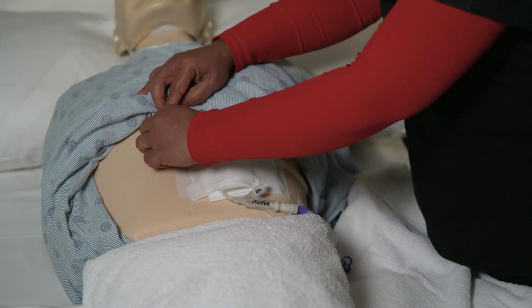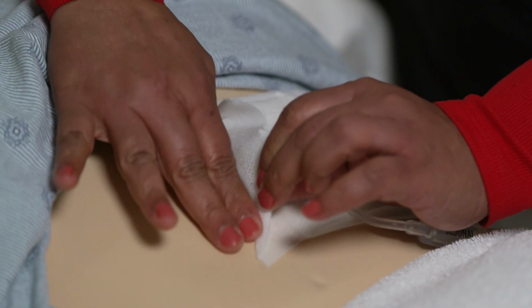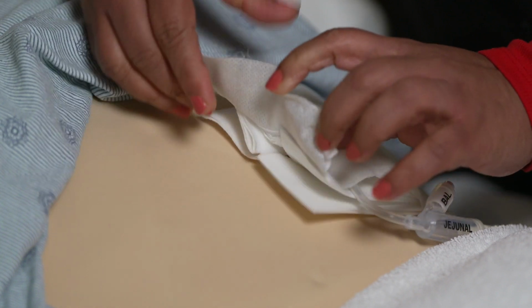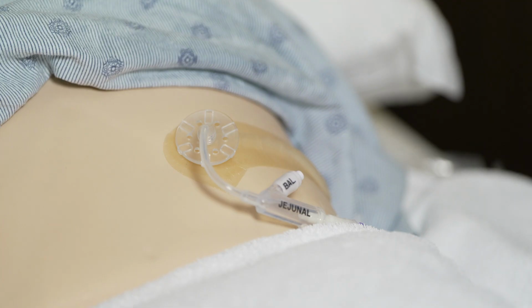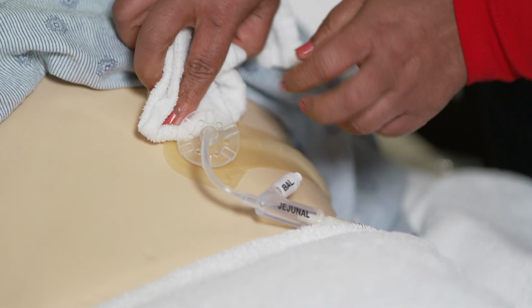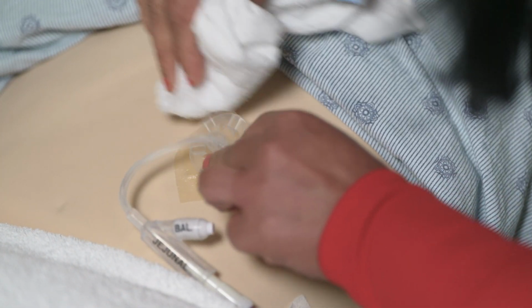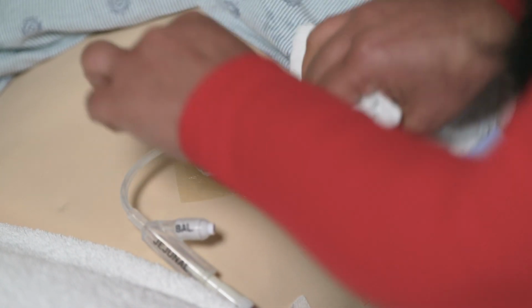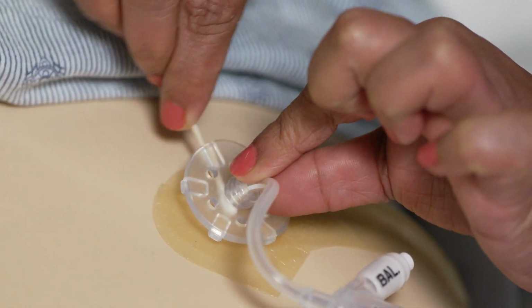Lift the corner of the dressing away from the skin and then gently push the skin away from the dressing. Keep doing this until the dressing comes off. Clean the J-tube site with a wet, soapy cloth. Next, clean off the soap with a wet cloth and pat dry. You may do this while taking a shower. Using a cotton swab, clean underneath the J-tube disc.